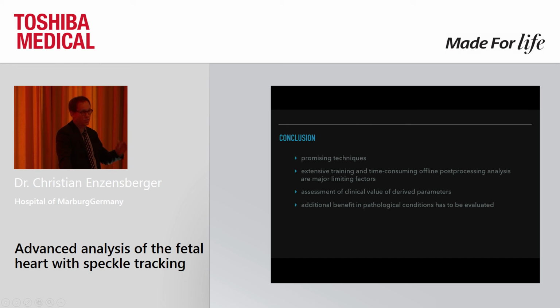That means when you have your patient and you do your scan, you save your raw data, and when the patient is already at home, you can do your analysis. That's the workflow at the moment. It needs to be changed, but this is not a Toshiba problem.